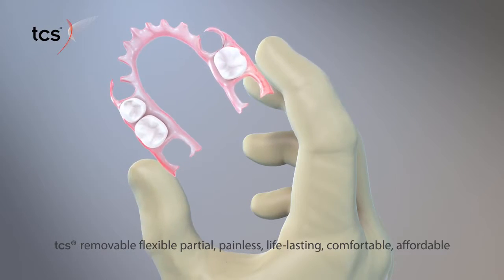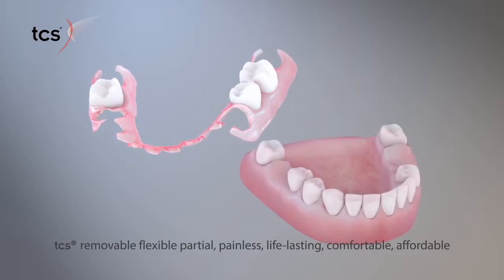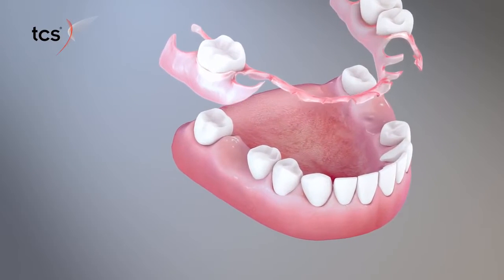C.S. Removable Flexible Partials offers a painless, life-lasting, comfortable, and economical solution for replacing missing teeth. The treatment is quick and non-invasive, with minimal discomfort.